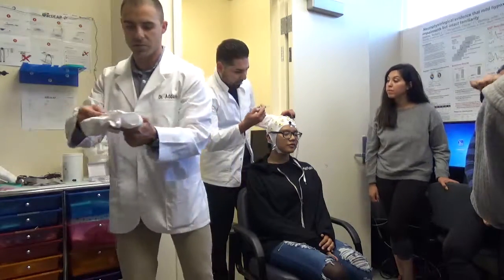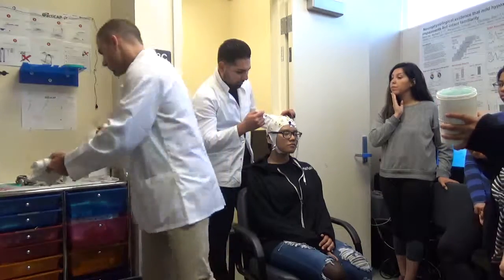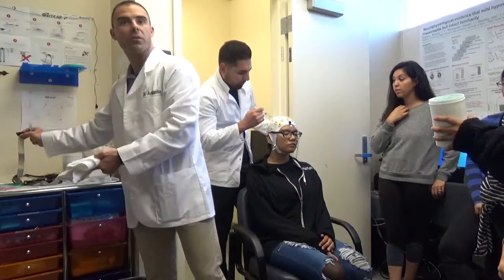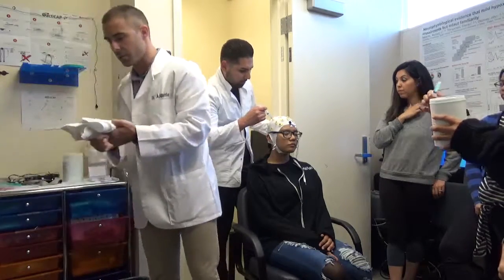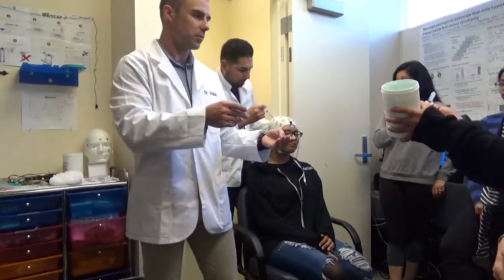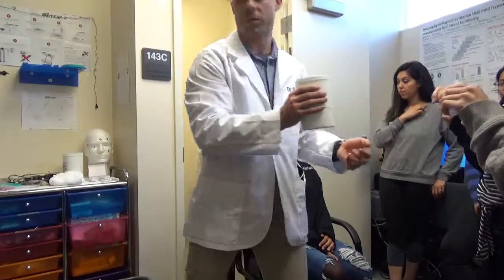Thank you, sir. So you get these little extra gel goops, so clean them off. And now, yeah. So the thing is you got to be mindful, because if I would have just put this down here, you start getting gel too close to this one. No good. So it's one of those things. Okay, so you put those 2 together. Does that sound good? It's just a screw top. I need to clean it up. Okie dokie.